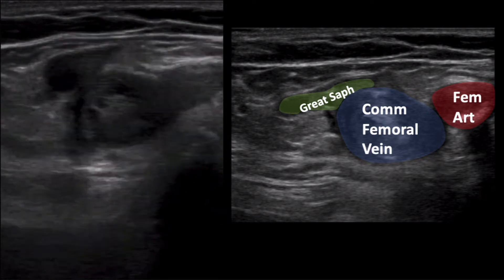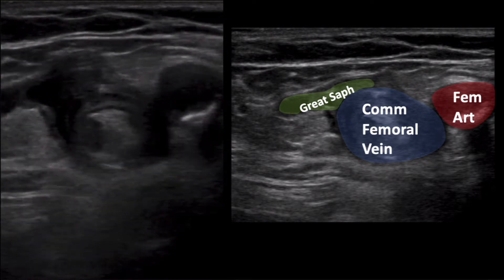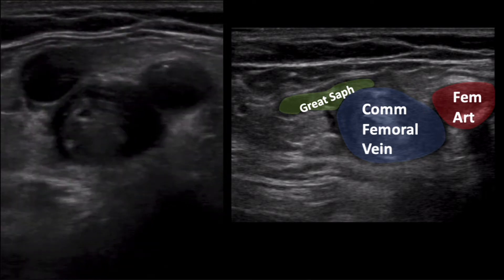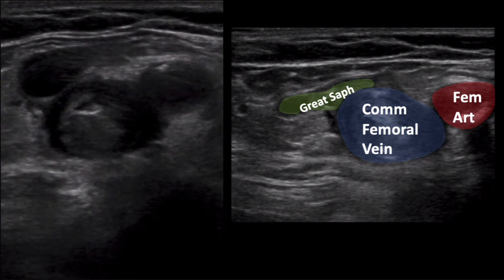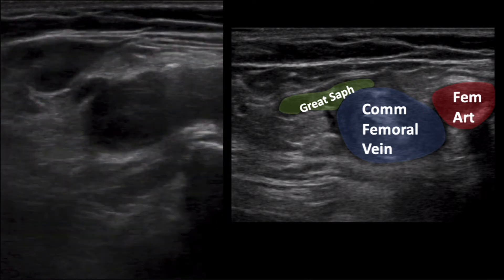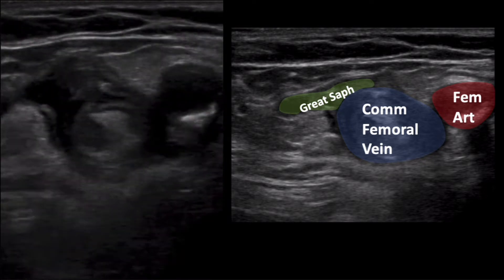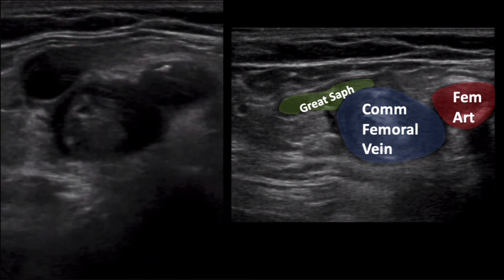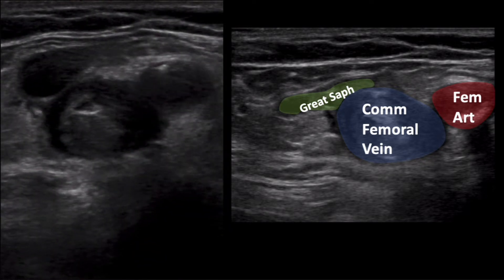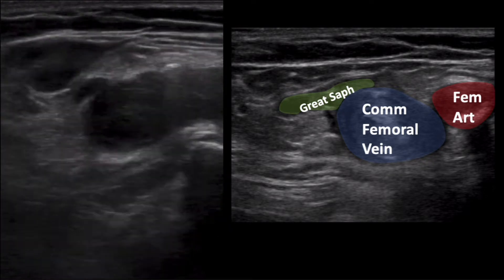The femoral artery is to the right of the vein, and the venous structure draining into the common femoral at this level is the greater saphenous. Hopefully you have appreciated the large amount of echogenic material and the incompressibility of the common femoral vein, both of which represent signs of deep venous thrombosis.